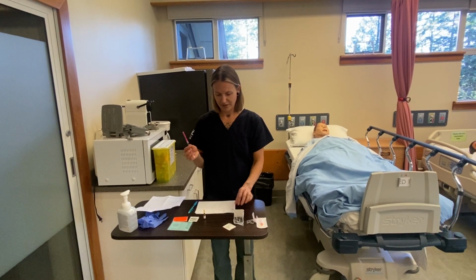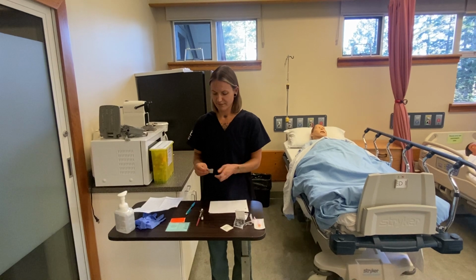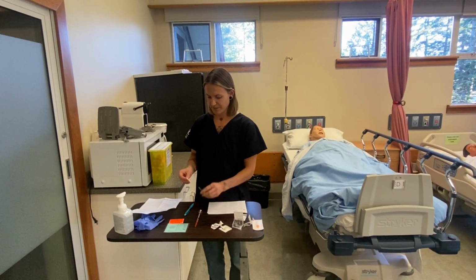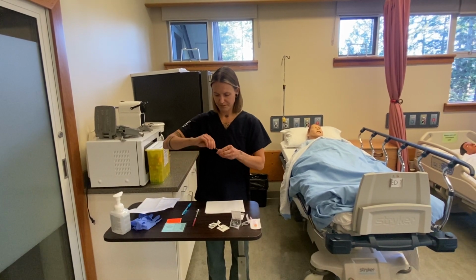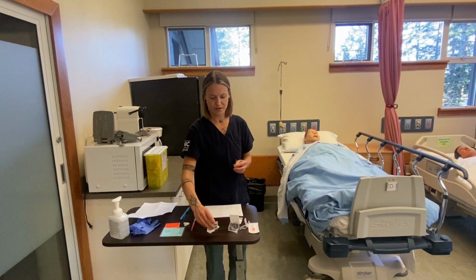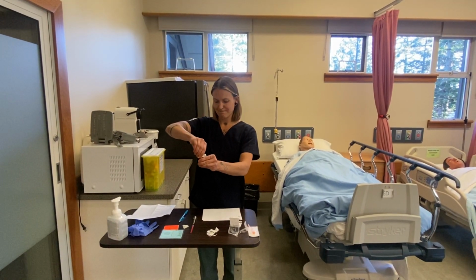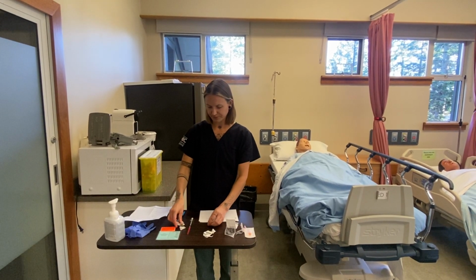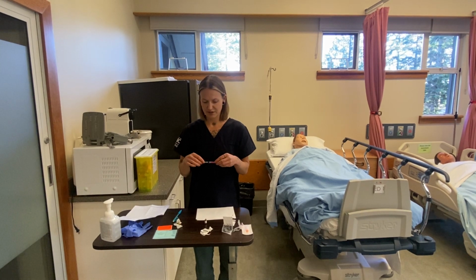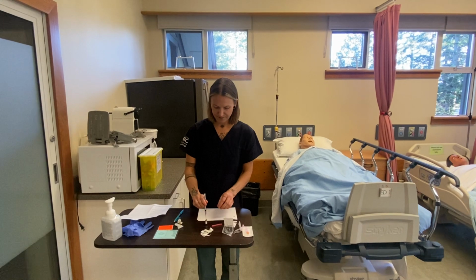And then I will clean off the top of the ampule with an alcohol swab. And then use another alcohol swab to break it away from me. And then I can use my syringe and my filter needle to draw up 0.25 mils.